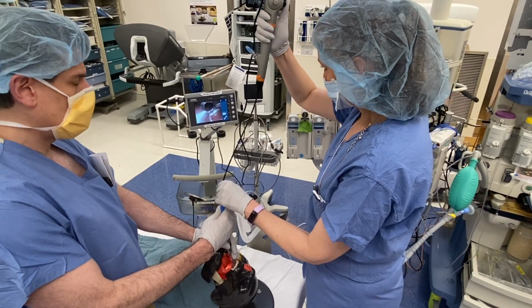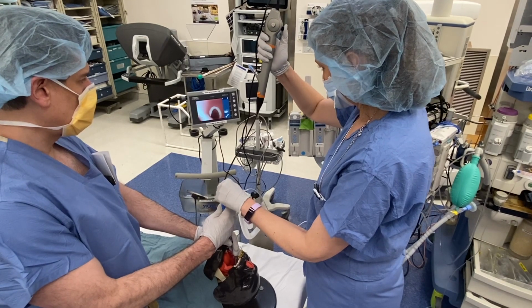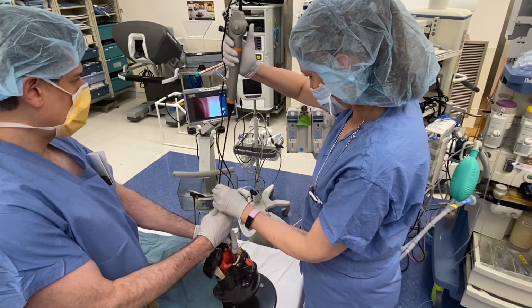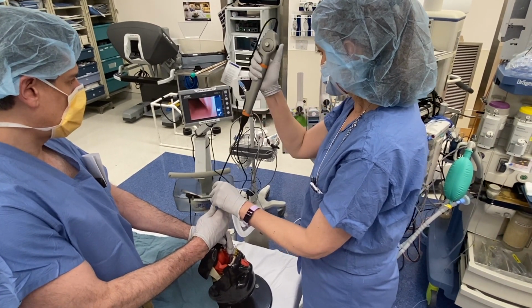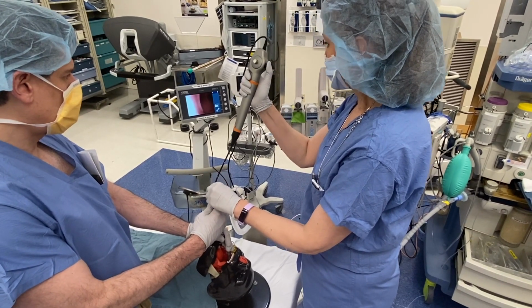At this point, it is possible to continually oxygenate and ventilate the patient. We recommend doing it in paralyzed patients to prevent coughing and bucking. The idea is that if your LMA is seated in the correct place, you will find yourself directly on top of the larynx, which was the case here. So we're now at the carina.